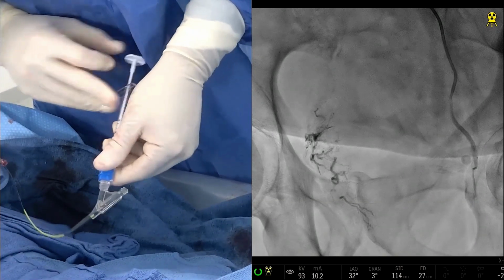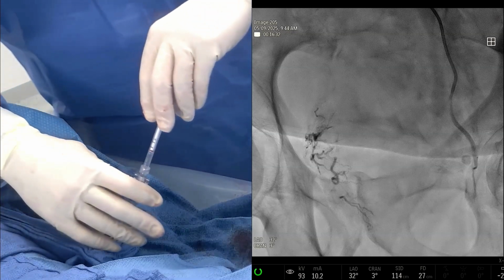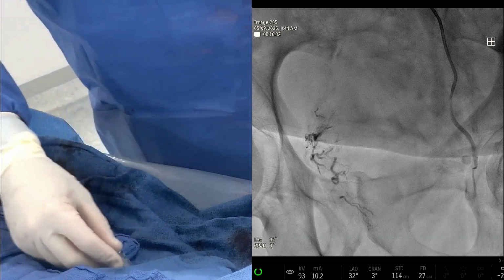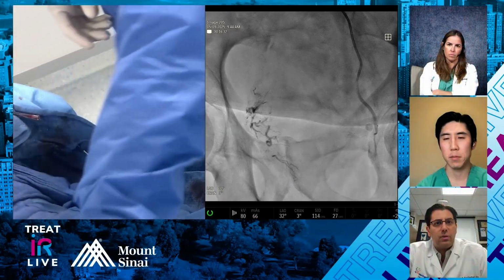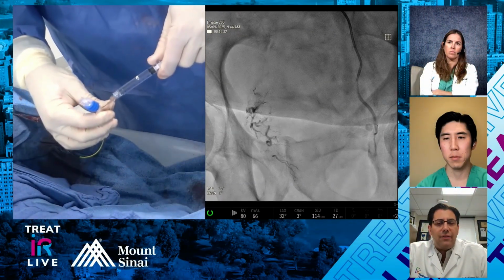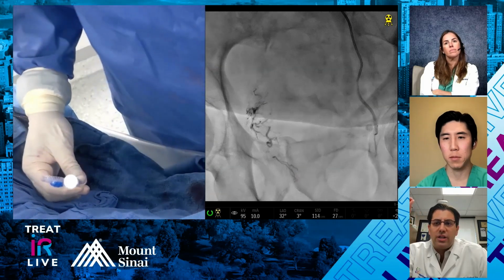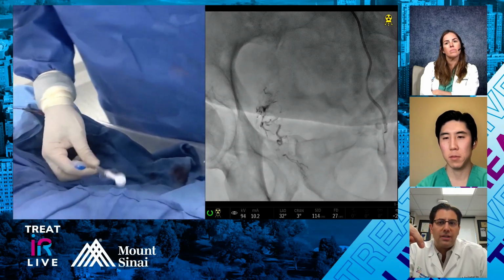Now it's occlusive. And so that was about half of that. So that was probably 0.12-ish. Not very much at all. Okay. I think the phenomenon that you're witnessing is important when you're using a liquid embolic. If I see this, I back up my diagnostic if it's wedged in there, so I have that ability of any forward flow to keep the glue from refluxing.